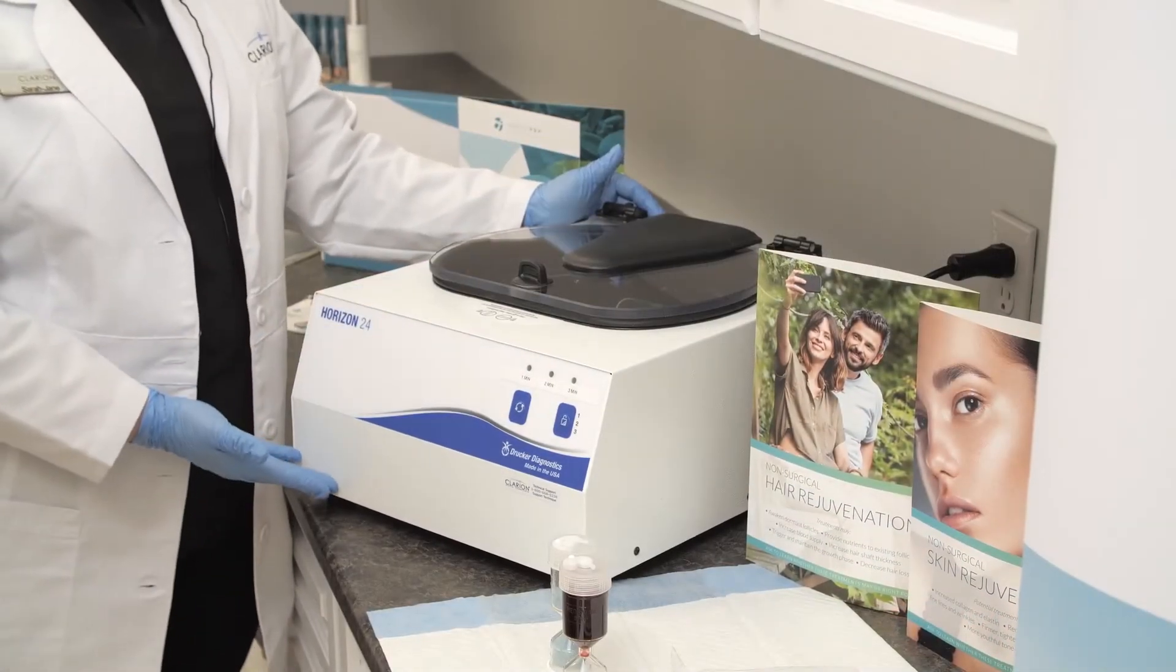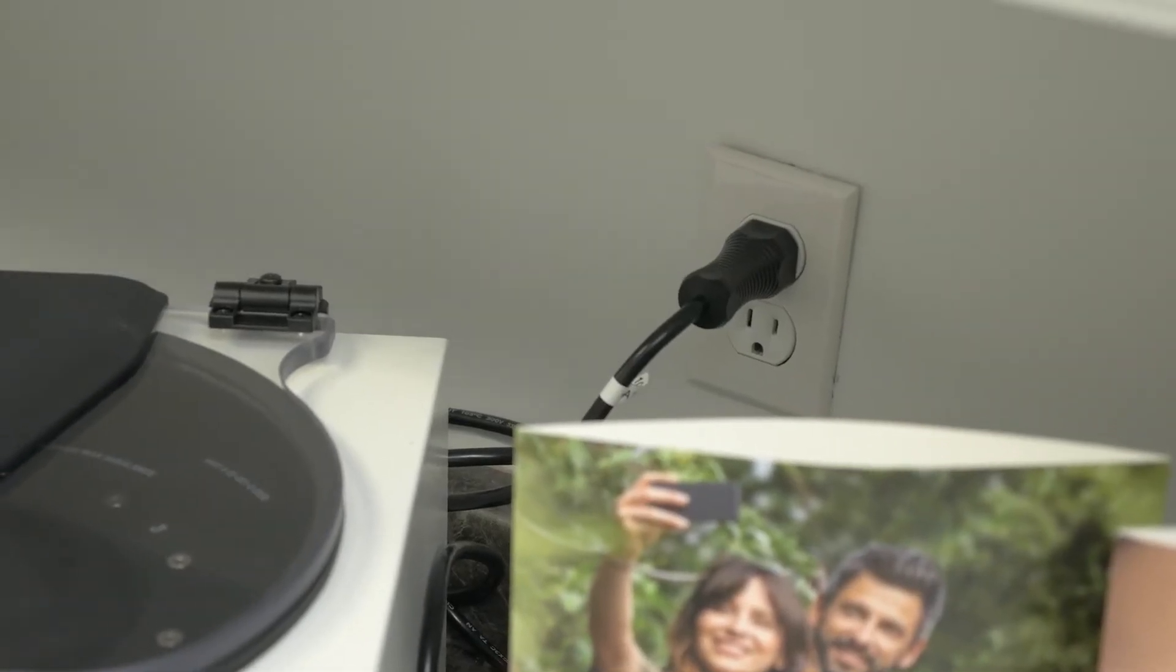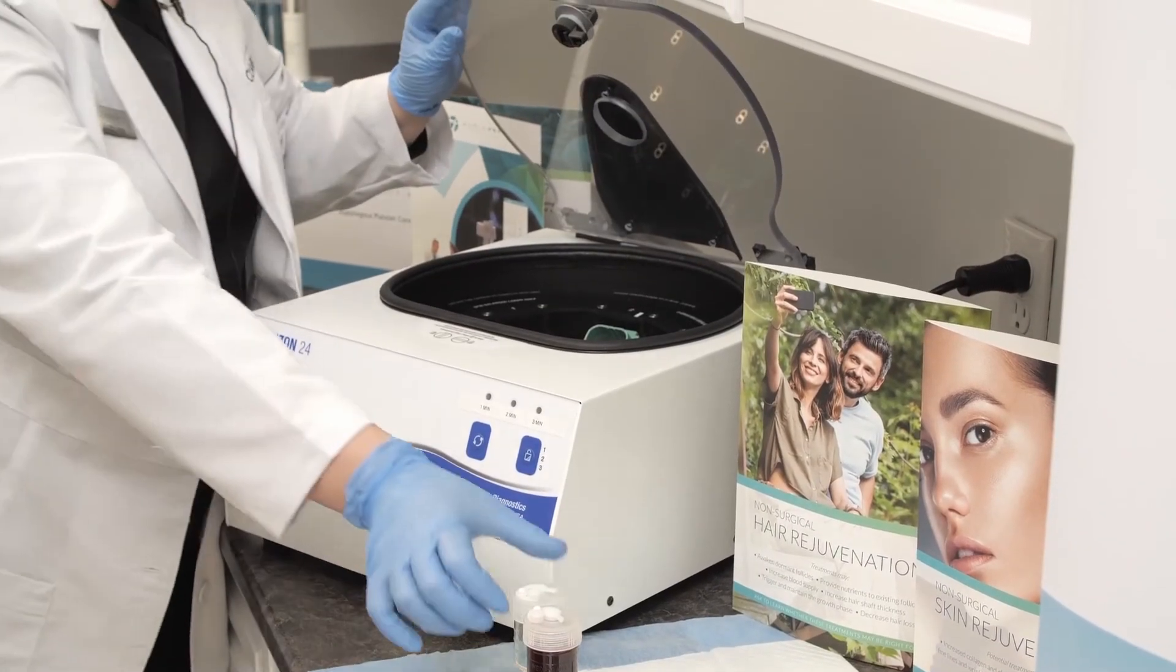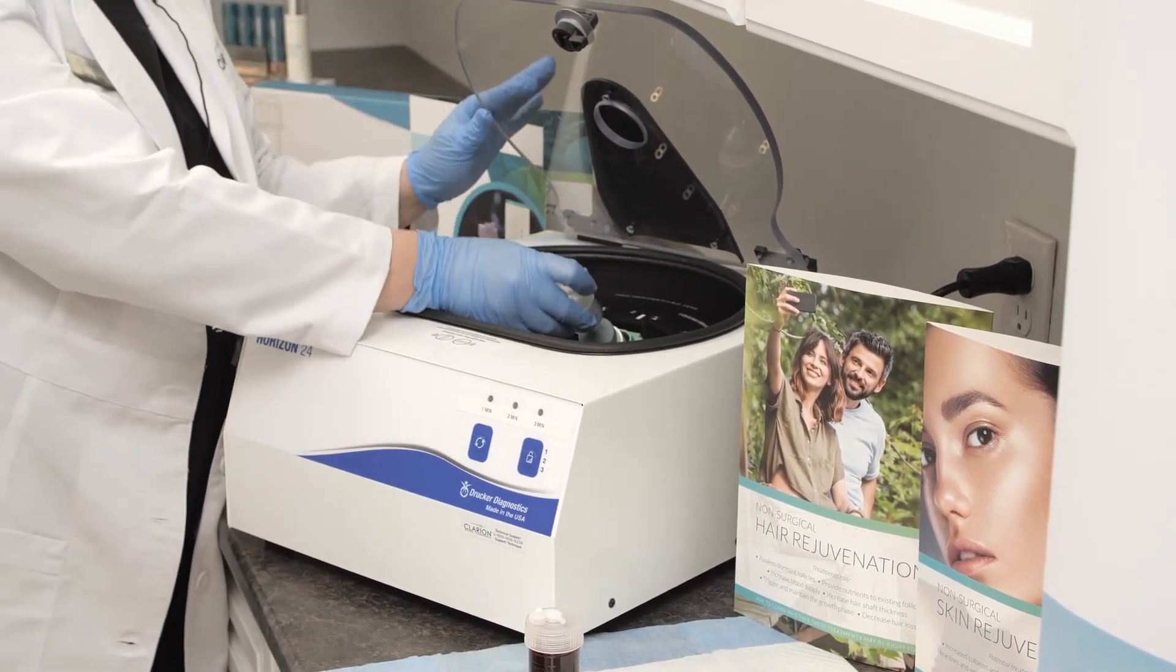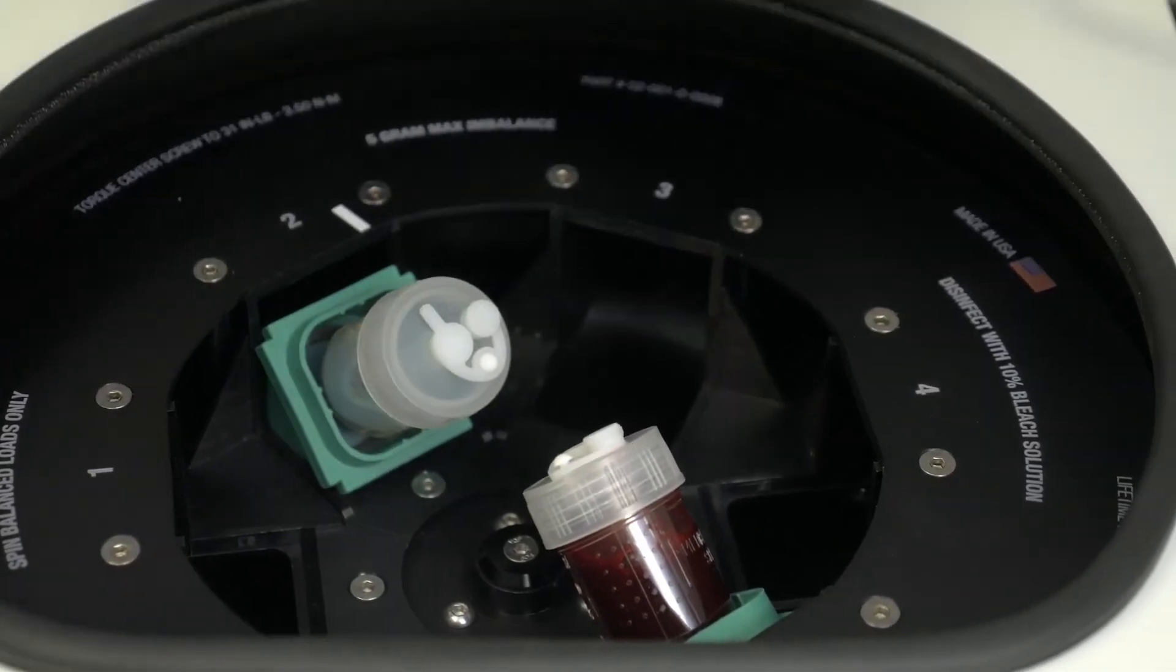Ensure the centrifuge is on a stable surface, power cord attached and unit is turned on. Both are located on the back of the centrifuge. Place the World PRP tube and counterweight tube into the centrifuge aligned across from each other. Close the lid and lock.